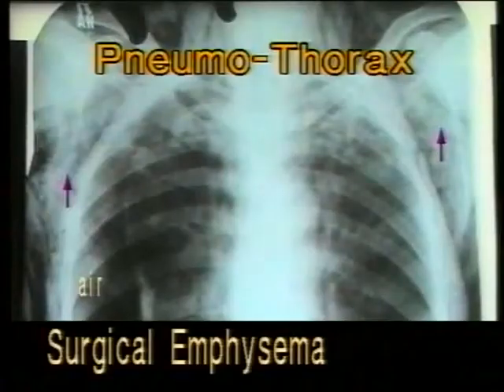If the pneumothorax is very small or not seen clearly, then the X-ray should be repeated in full expiration, when pneumothorax is demonstrated more clearly. If the pneumothorax is traumatic, you should look for rib fractures and inspect the subcutaneous tissues for surgical emphysema.